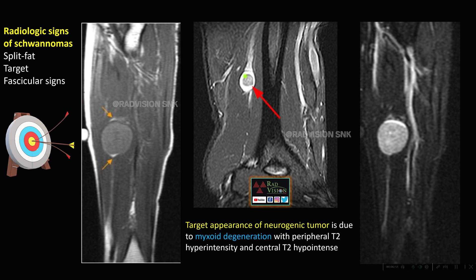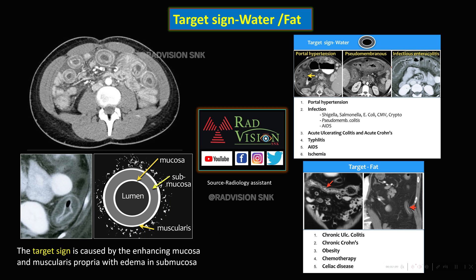Next: this is a common target sign seen in peripheral nerve sheath tumors such as schwannomas. The target sign is due to myxoid degeneration, where you can see a central T2 hypointense area surrounded by a peripheral T2 hyperintense rim. Additionally, split fat sign and fascicular sign are commonly seen in schwannomas.